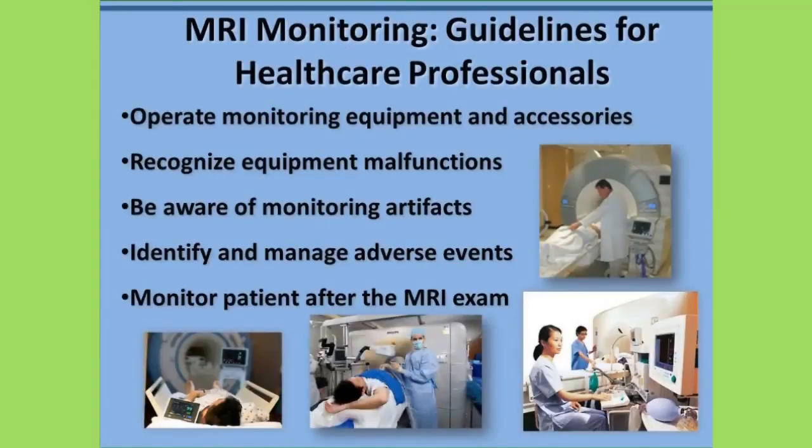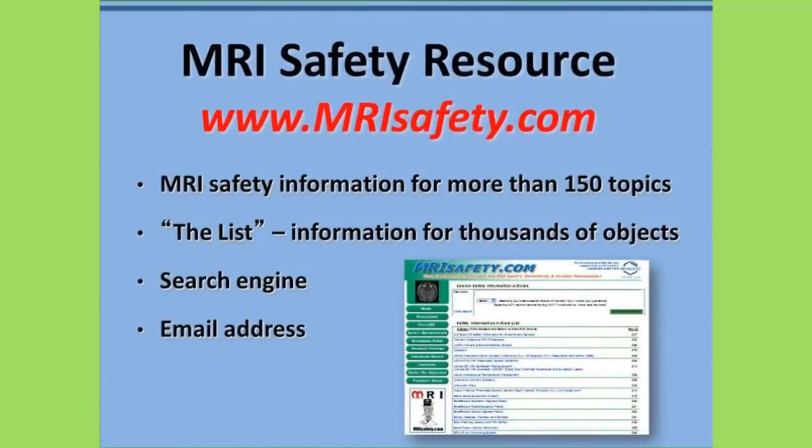Healthcare professionals with appropriate training and experience are the only individuals permitted to perform patient monitoring during MRI. These healthcare professionals should be well acquainted with the operation of the monitoring equipment and accessories used in the MRI setting and be able to recognize equipment malfunctions, device problems, and recording artifacts. In addition, these healthcare professionals must be properly trained to identify and manage adverse events using appropriate equipment and procedures in the MRI environment.